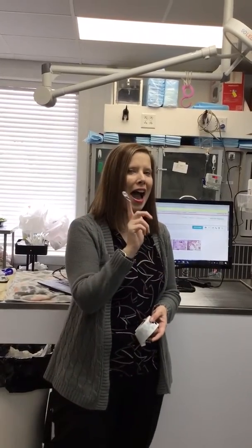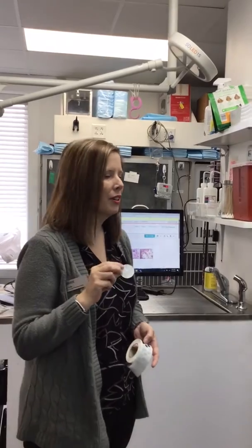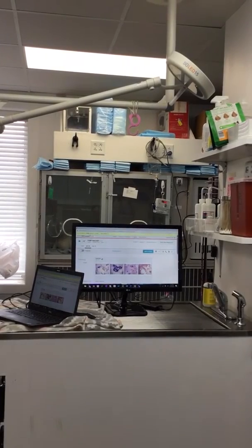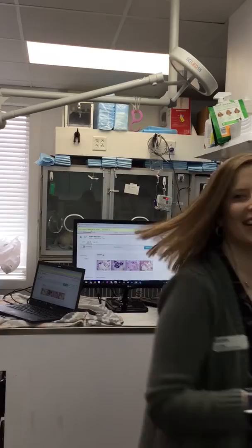Tracy. For the whole blood separator, which is a little disc with the green top, have y'all all used those? Yes. Okay. How much blood do you put in those whole blood separators? 0.7. Okay, who all said 0.7? Woohoo! There we go. That's what I'm talking about. All right.